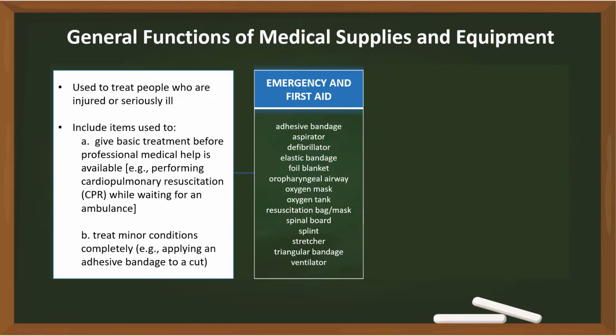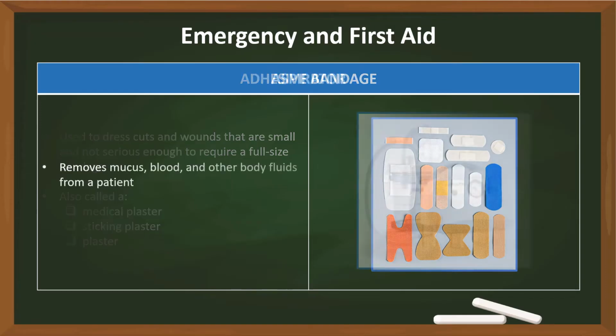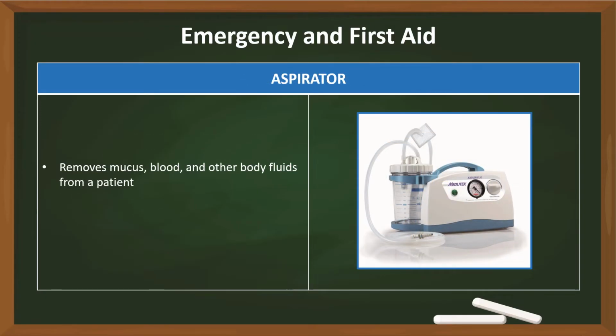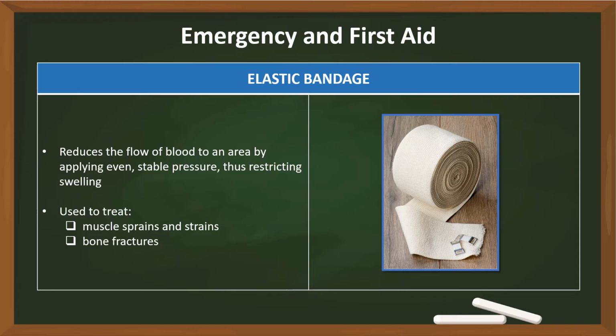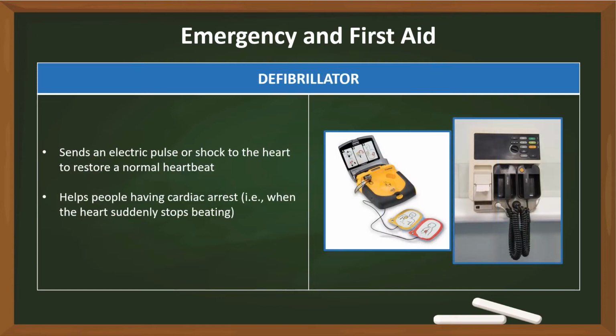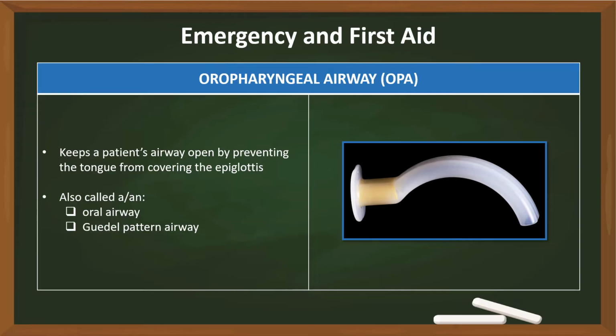They include adhesive bandage, aspirator, elastic bandage, defibrillator, foil blanket, oropharyngeal airway.